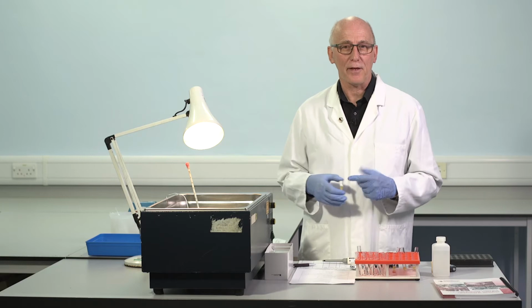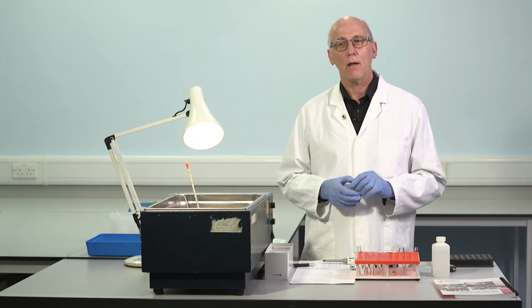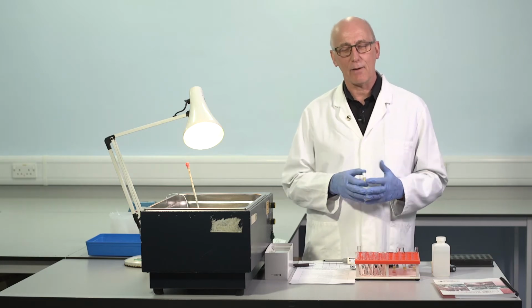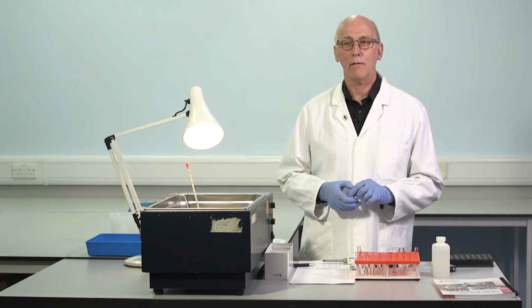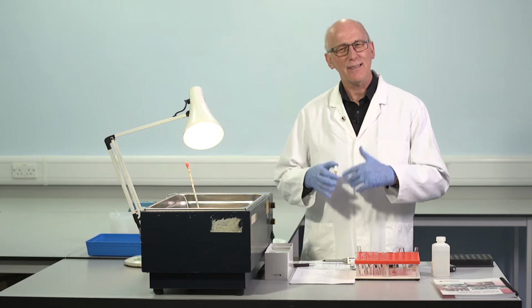And we do a simple thing in my centre. We use fresh frozen plasma. And you're probably well aware that the ratio of anticoagulant to plasma is a little different. It's a little bit more dilute in fresh frozen plasma than is the case in citrate of blood.